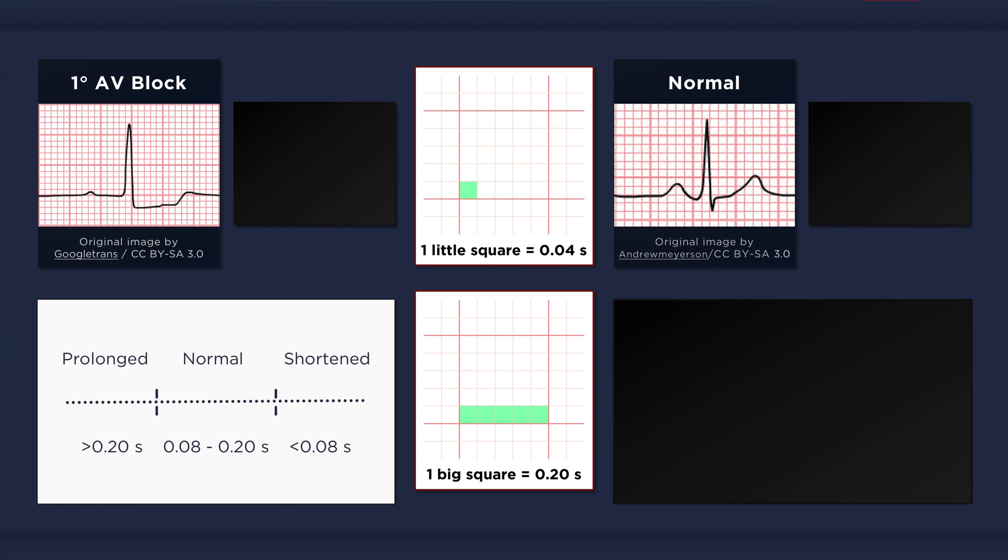A normal PR interval is between 0.08 and 0.2 seconds. Any duration exceeding 0.2 seconds is considered prolonged. And in some cases, the PR interval may extend even beyond one full second. With such extremely long PR intervals, the P waves can become obscured or hidden by the T waves.